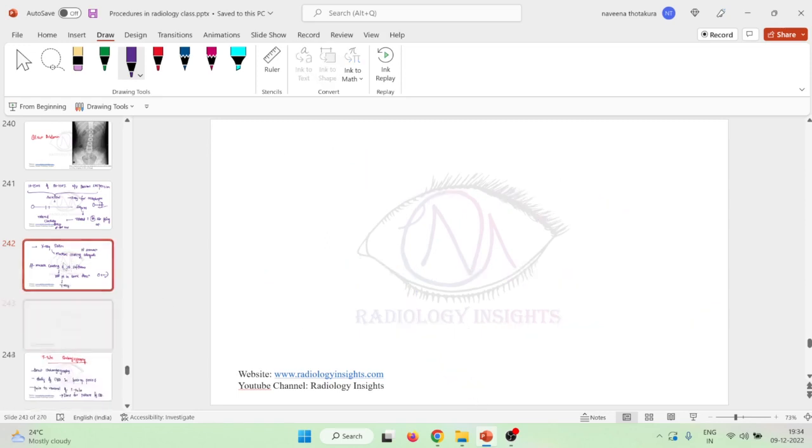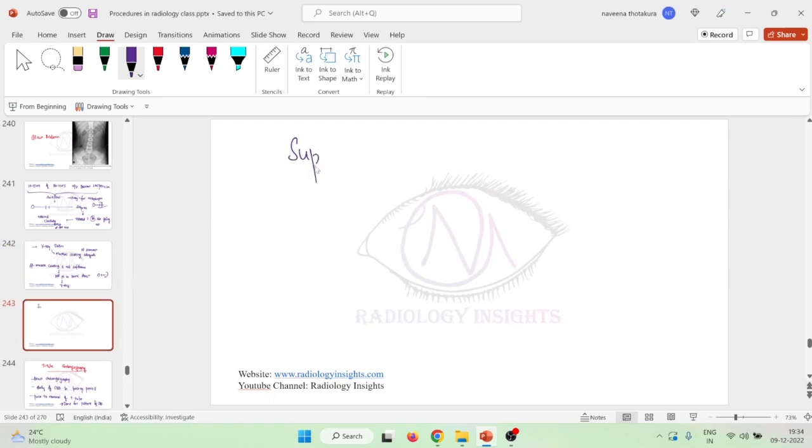Now the patient is still lying in supine position, and now you should give the patient 100 to 250 ml of barium.